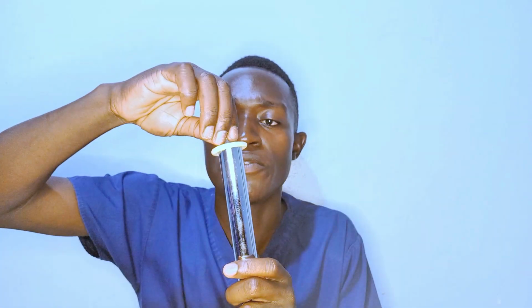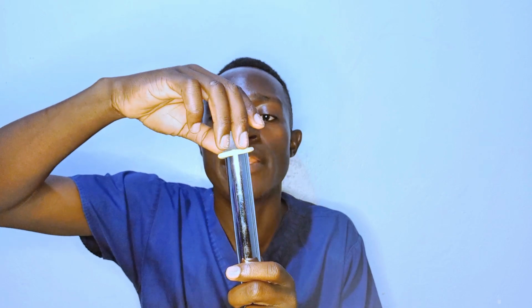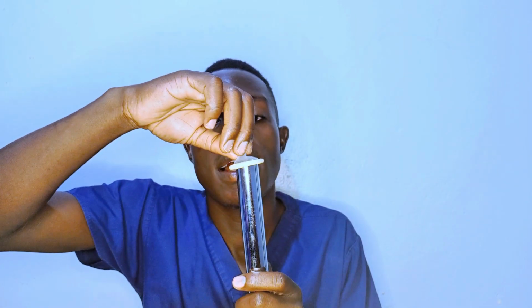You see that this condom has some lubrication here, if you can see a little lubrication. So we pinch and remove excess air. And while removing the air, you should also leave a small space. You should not just pinch and remove it completely. You should pinch and leave just a small space for the ejaculate, or the semen coming out from you during ejaculation. That is the place where the semen can be stored.